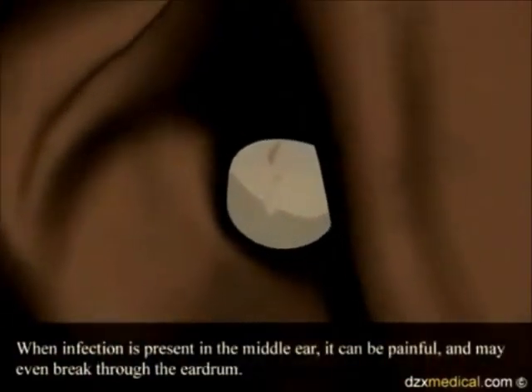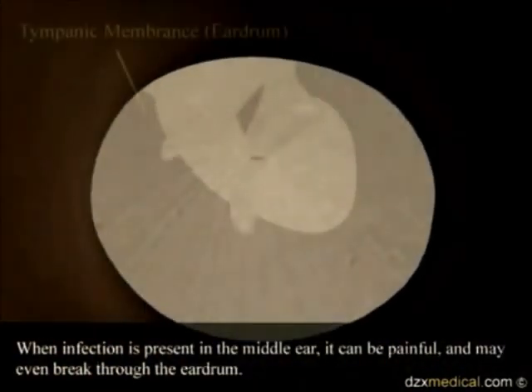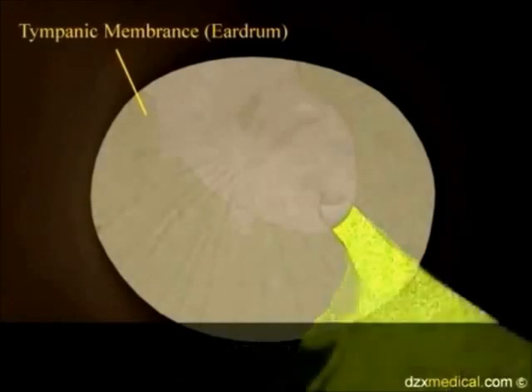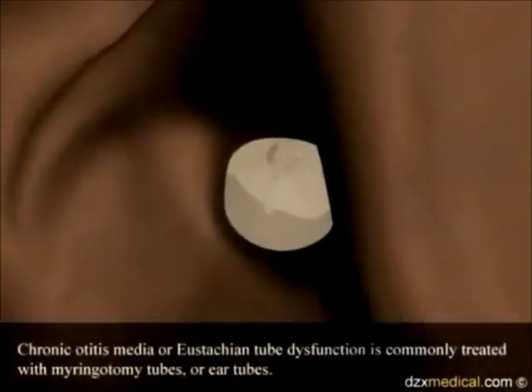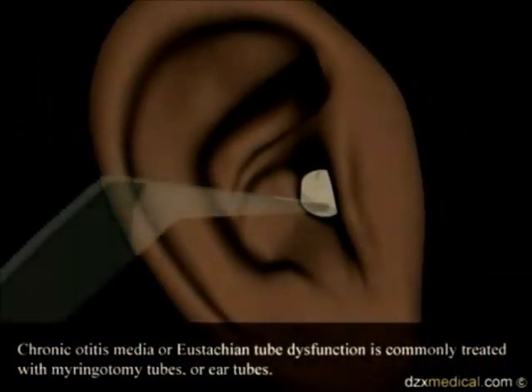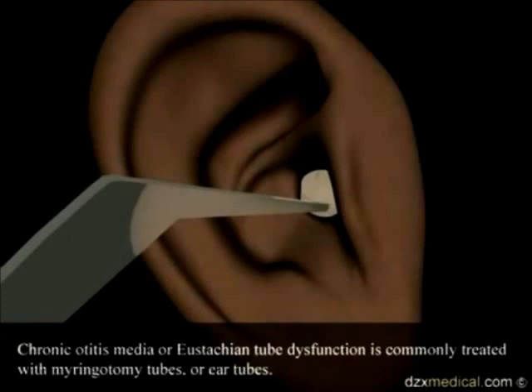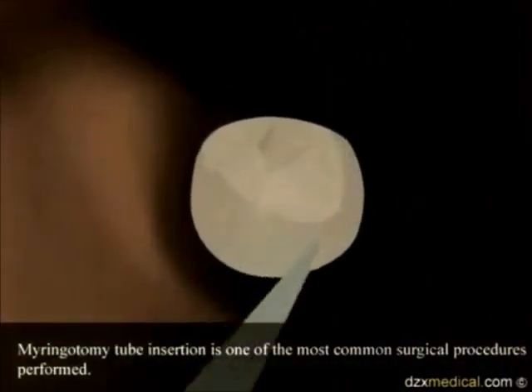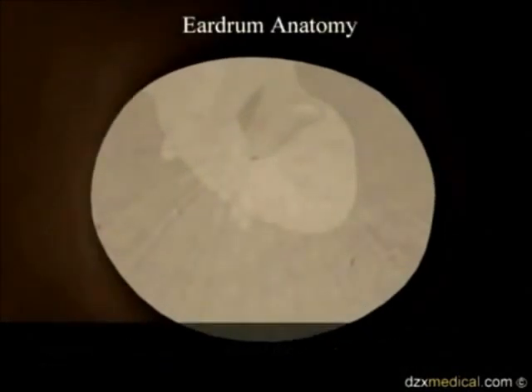When infection is present in the middle ear, it can be painful and may even break through the eardrum. Chronic otitis media or eustachian tube dysfunction is commonly treated with myringotomy tubes or ear tubes. Myringotomy tube insertion is one of the most common surgical procedures performed.